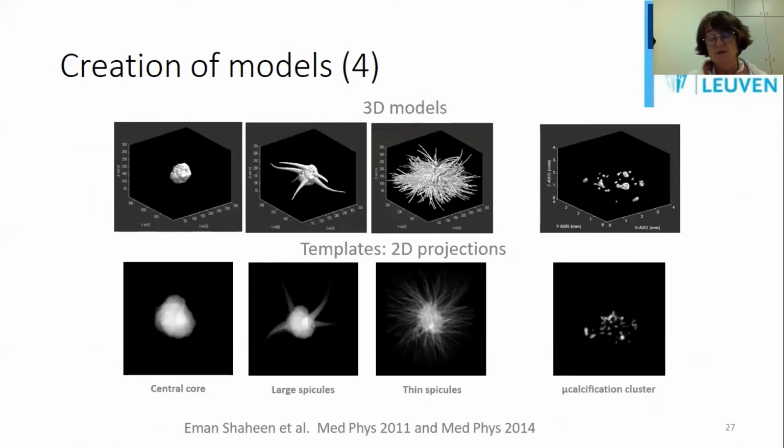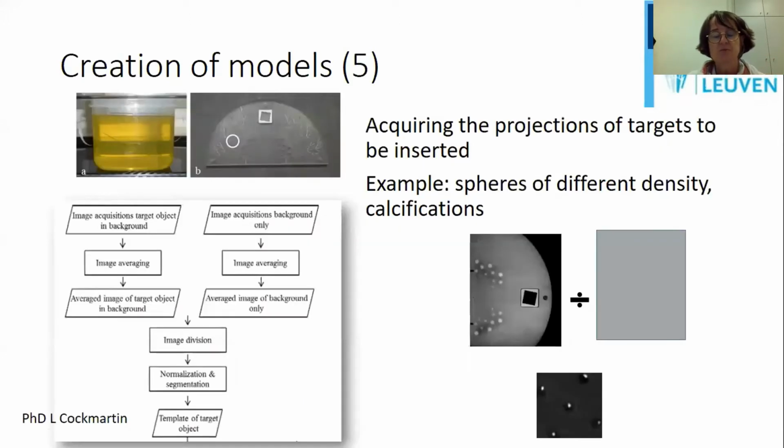I must tell that at this moment, and I forgot to include it here, we also have artificial intelligence approaches, in fact GANs, that help us create more masses.